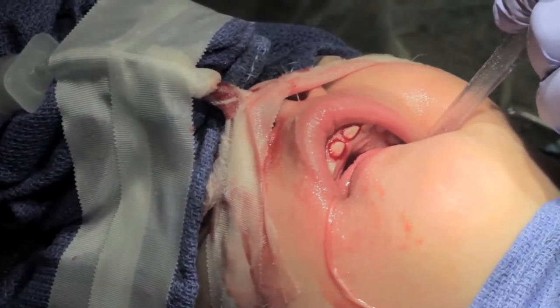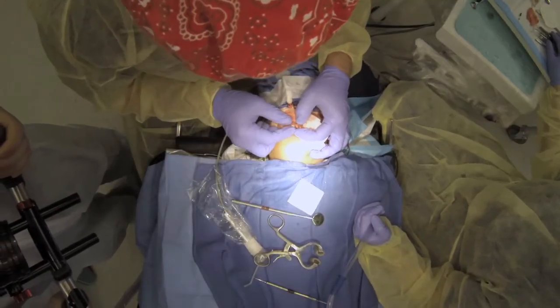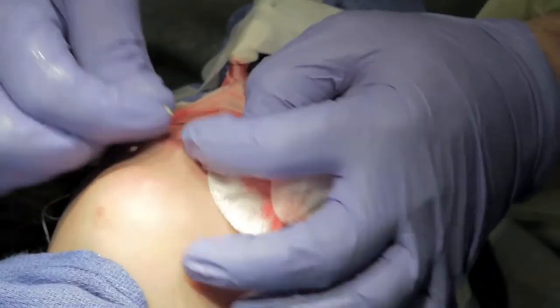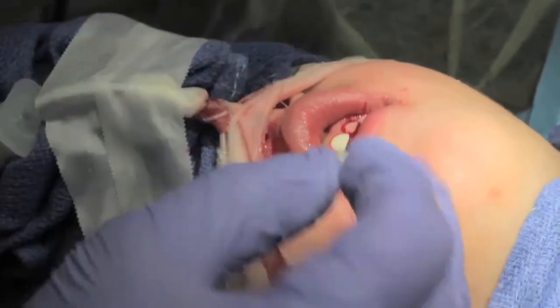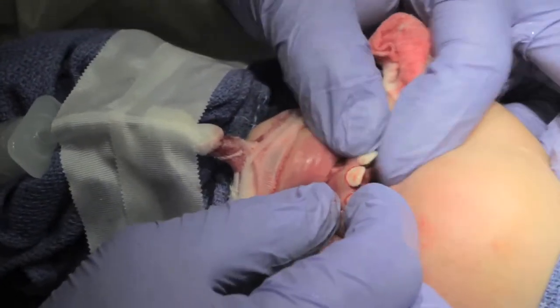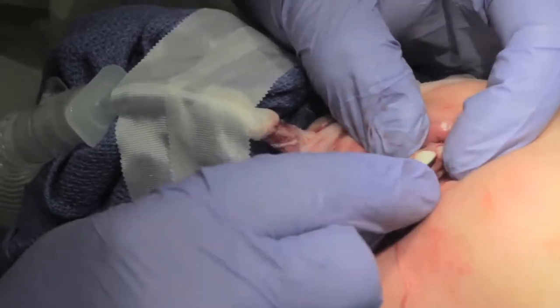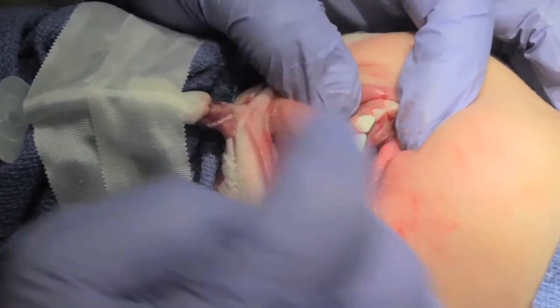Now we can try on some crowns. I'll try a central right size two — that goes over pretty nice, but let's try one size smaller: central right one. Perfect. Let's try a left central one. Perfect. So the size is perfect. You don't want them fitting too snug because it puts too much pressure on the facing, but you want to make sure you can get them straight and aligned. These are pretty good.